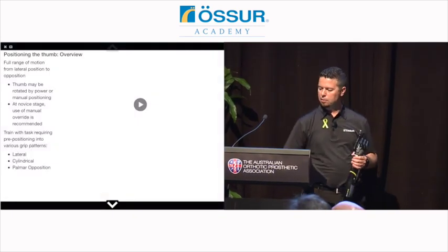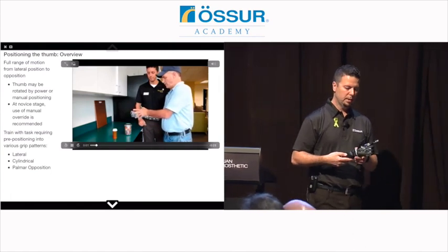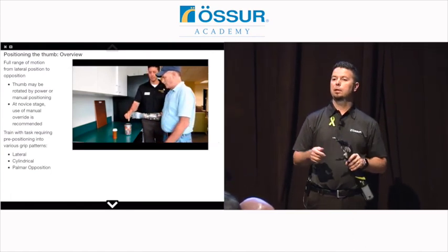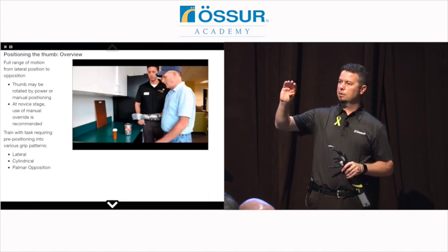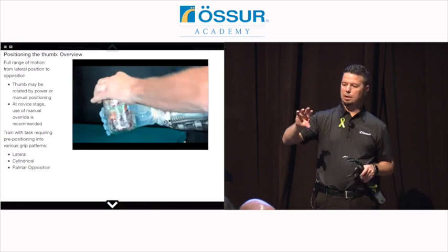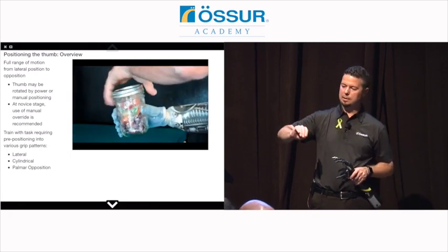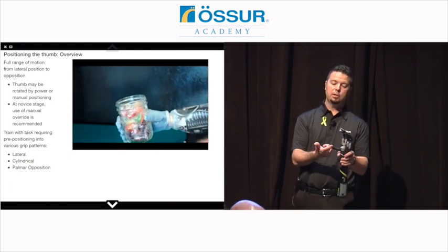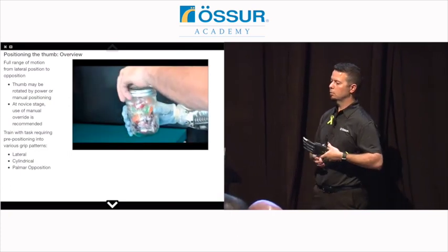And then positioning the thumb. We want the user to understand that that thumb has all sorts of rotation capabilities, especially if they are coming out of a hand that had that tripod pinch. This is a new concept for them. With that standard hand, they had to compensate with that tripod pinch whenever they're performing tasks. Now you want to teach them to rotate that thumb based on what they're holding or picking up.